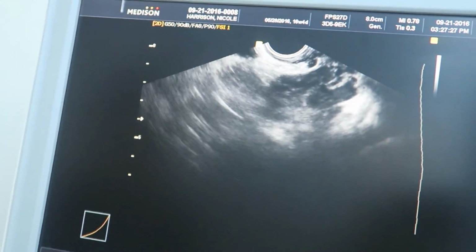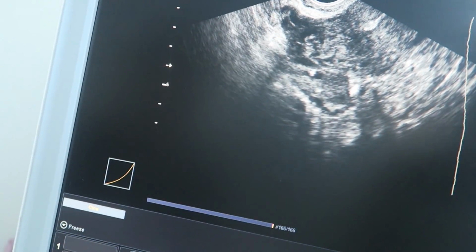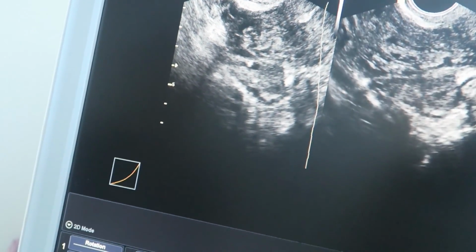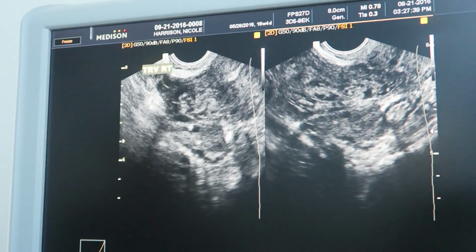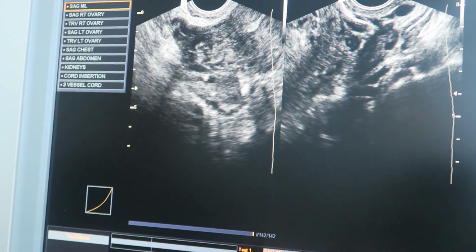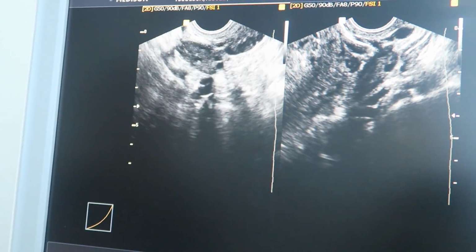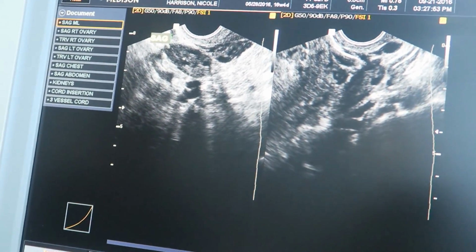Okay, now I just need to document your ovaries. So I'm just going to show that its home is hospitable, basically. I'm going to push here, and then come way over on your left. So not quite as far as what your menstrual history indicates. But now we have a measurement of how old it is. And again, the accuracy is plus or minus 6 days.